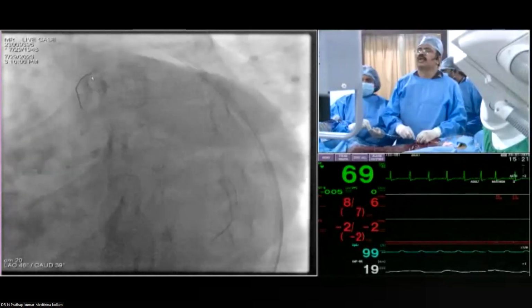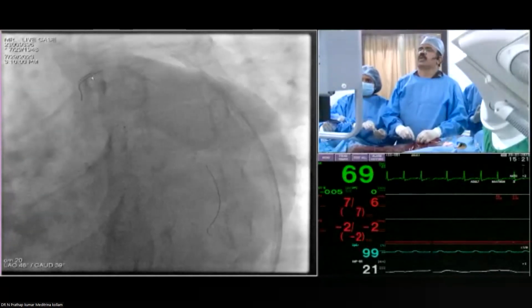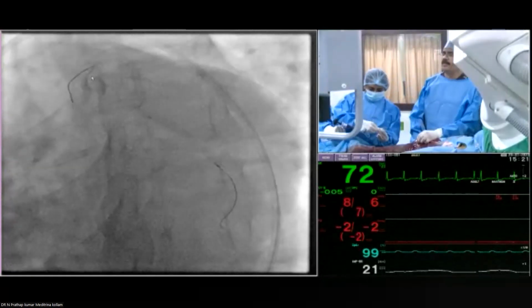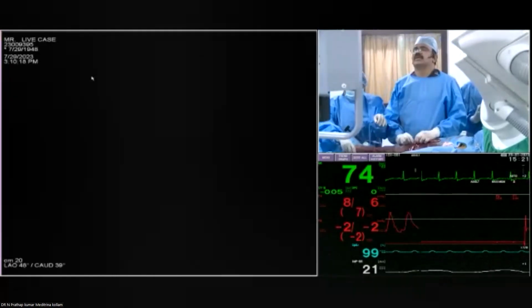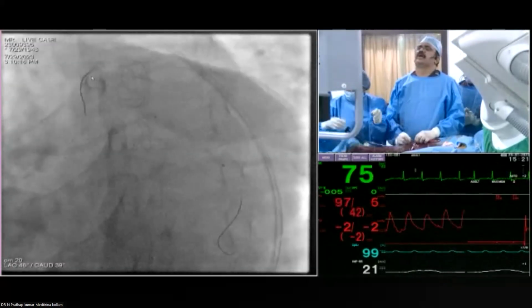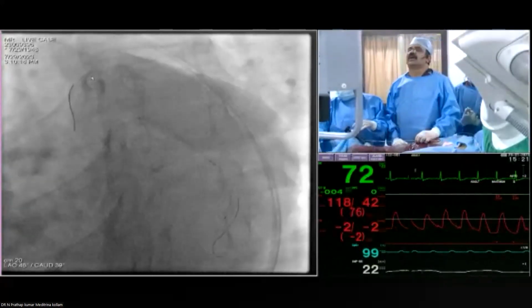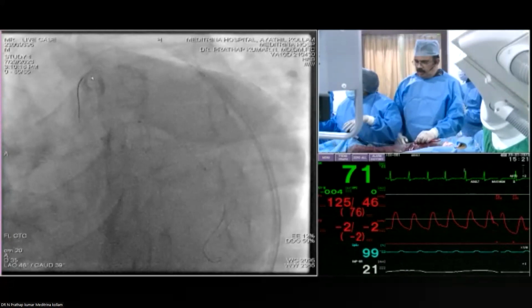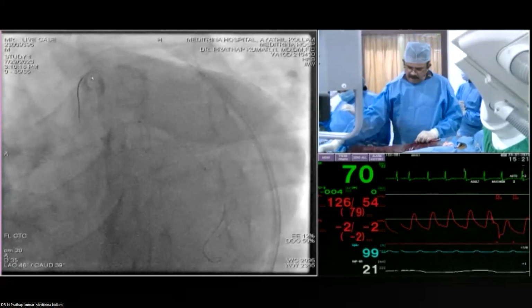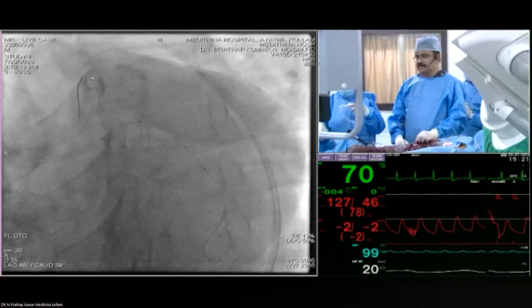Moreover, if anything happens to the patient, this is actually, I'm taking a 3x28 stent. I've just taken the stent down. You can see that the stent is actually taken down. Now I will take a 3.5 millimeter balloon minimum. I'll take it for a crush. 3.5 into 12 millimeter balloon. And after that, I'll recross into the circumflex and create a first kiss.